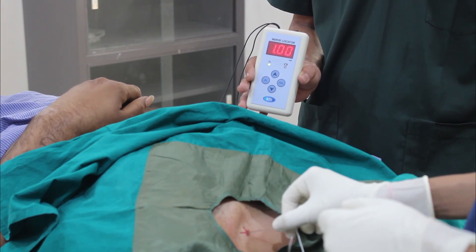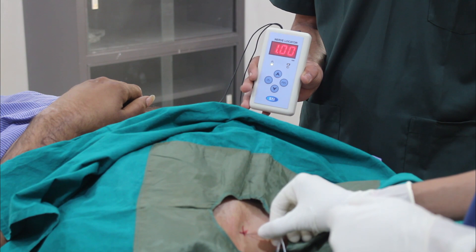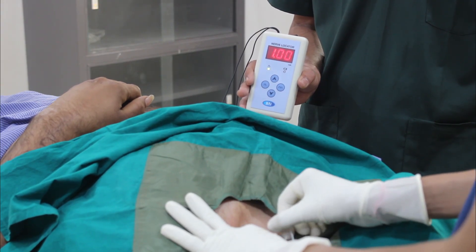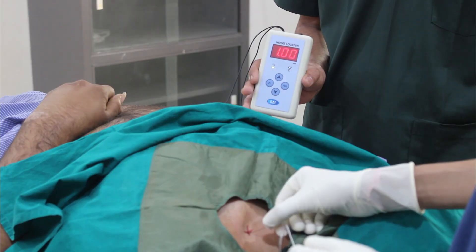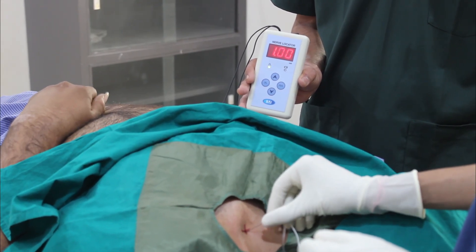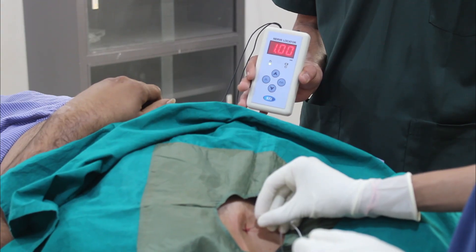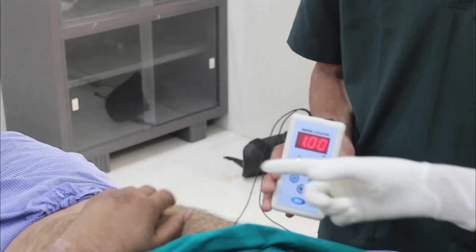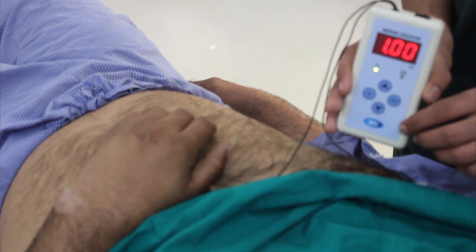I am getting biceps contraction, but you should not accept that as a desired motor response. You can see I am now getting finger extension — that is due to stimulation of the radial nerve. Nice finger extension is coming at 1 mA current, so I will reduce current down to 0.8 mA. At 0.8 mA current also I am nicely getting finger extension.